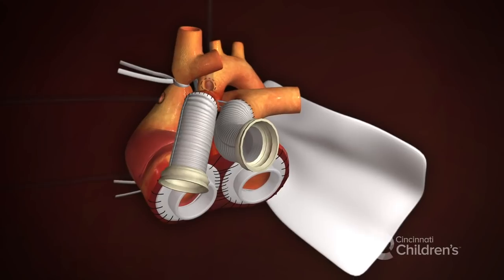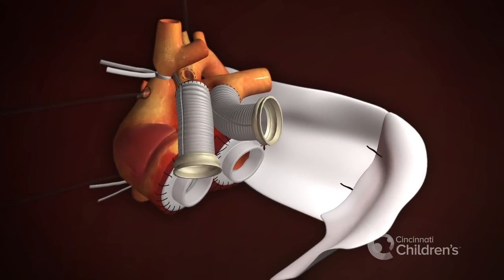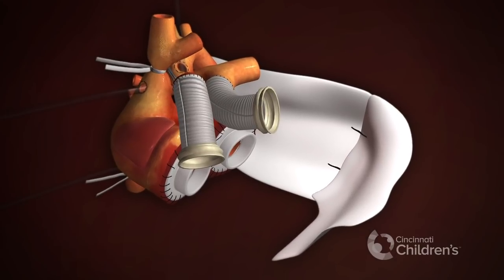Building the neopericardium with Gore-Tex pericardial patches on the left lateral side, down to the pulmonary veins, and then along the diaphragm.